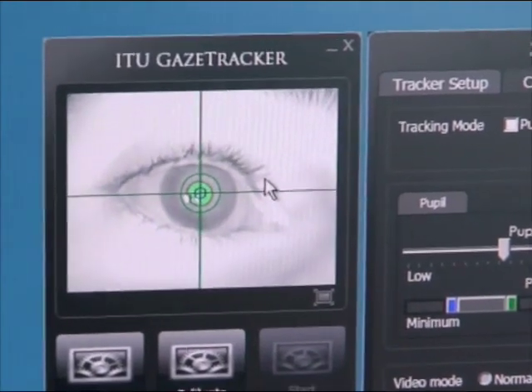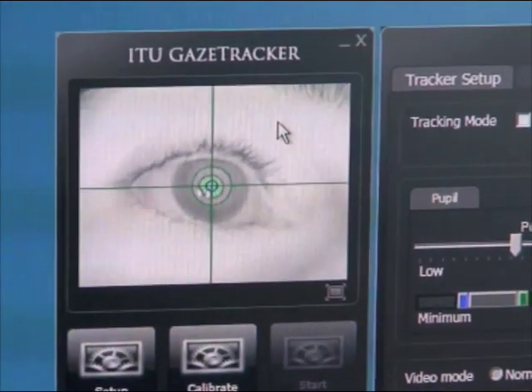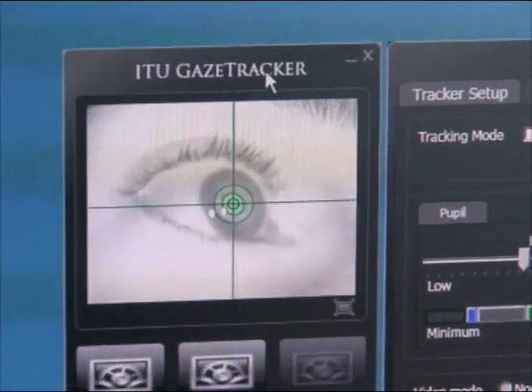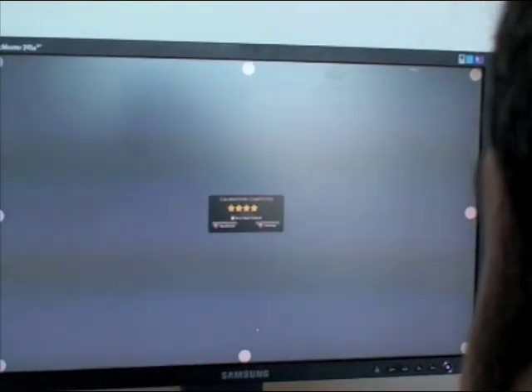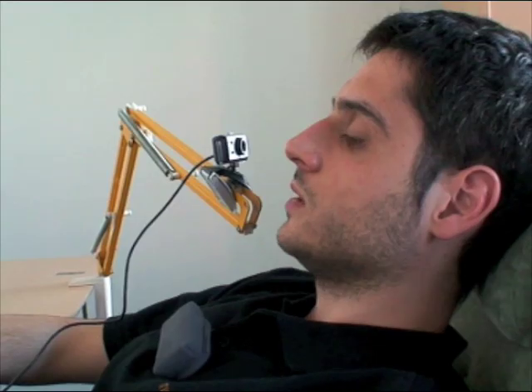The calibration procedure is just the same as in the other setup. We can also mount the camera on the arm of an office lamp. This is particularly useful when the user is lying in bed or when the user cannot hold the camera in his mouth.